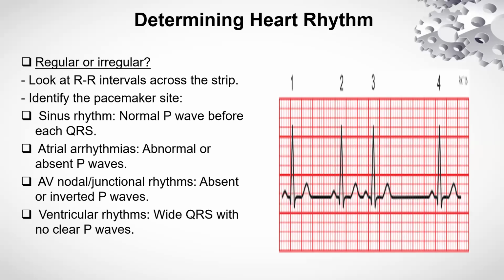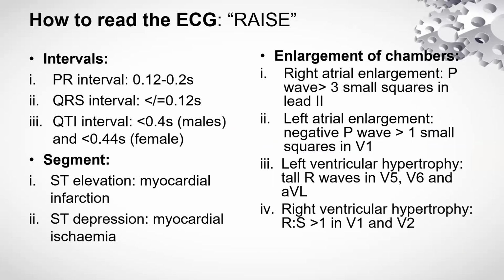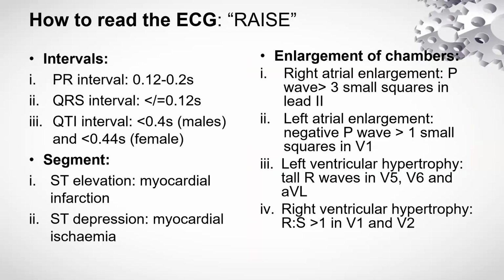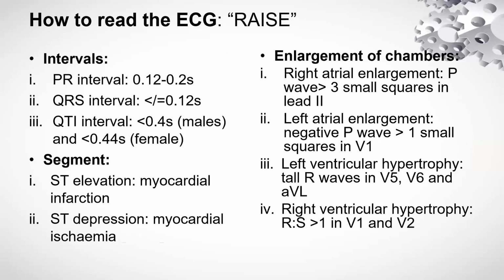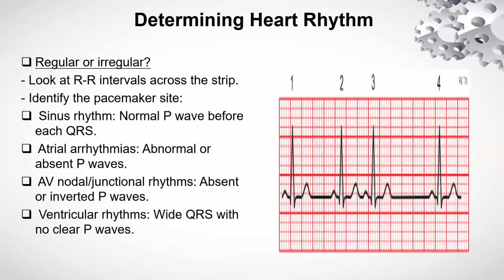Another thing, look at the PQRS complex. The P wave is always followed by QRS. Now, is the P wave always followed by QRS here?